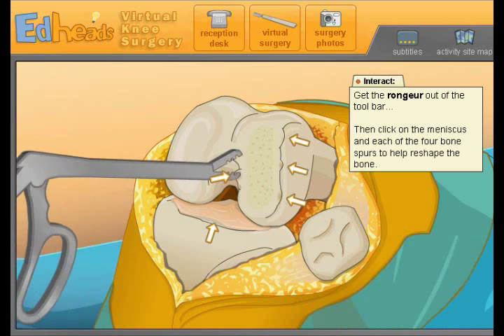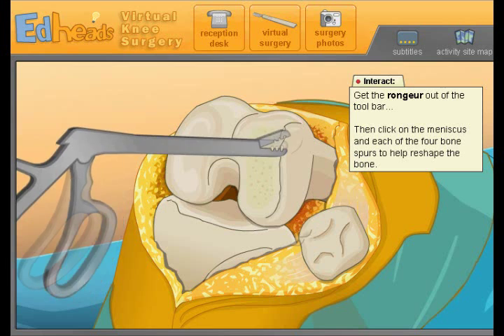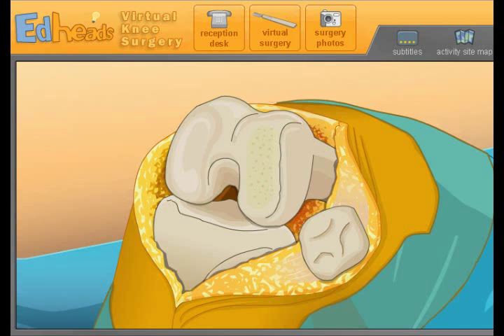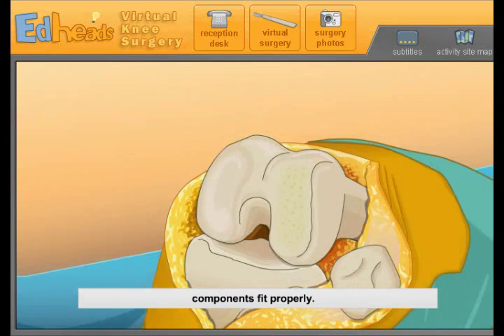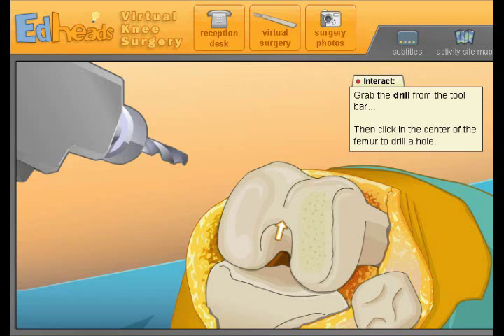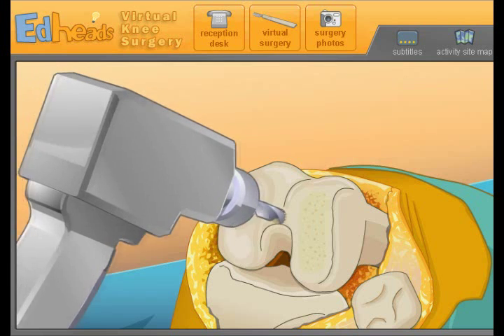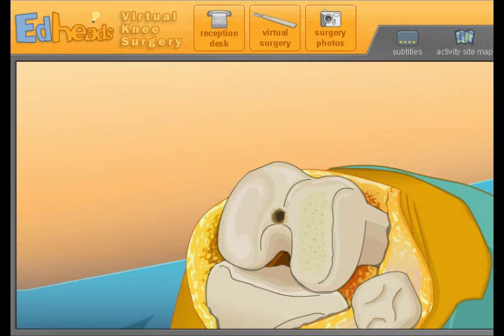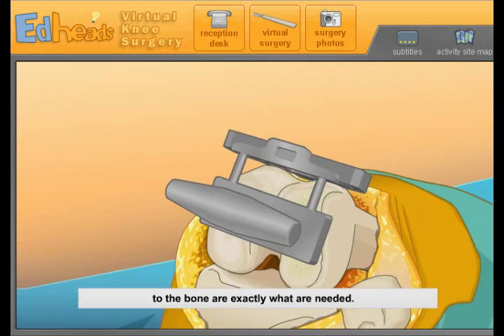Oh, now we're going to take this and snip parts of his bone off. Are you a good sculptor? It's time to shape the femur, tibia, and patella so the new knee components fit properly. A hole must be drilled inside the femur to set up the distal femoral cutting jig and alignment device. Ladies and gentlemen, this is a drill going into this man's knee!